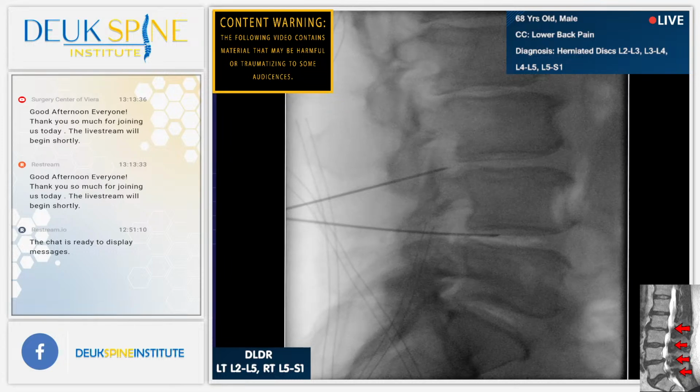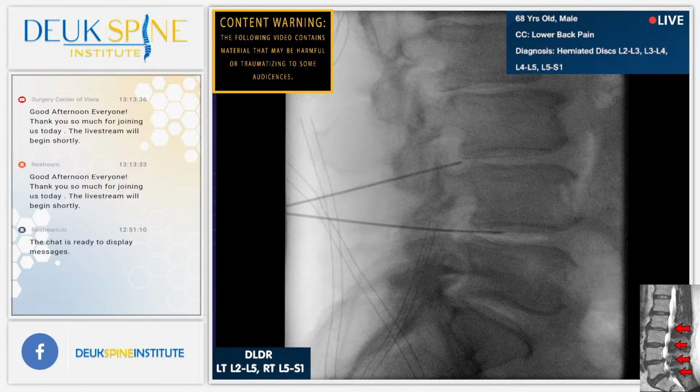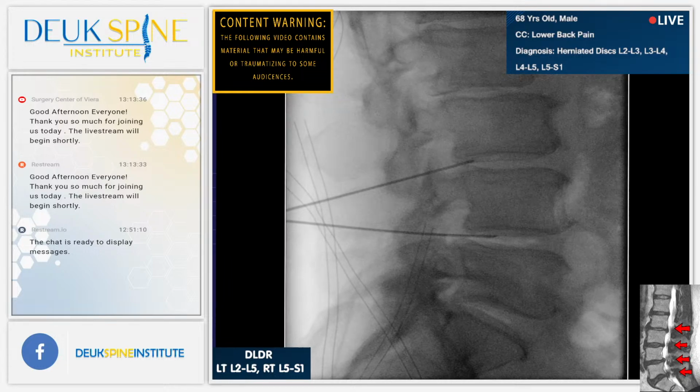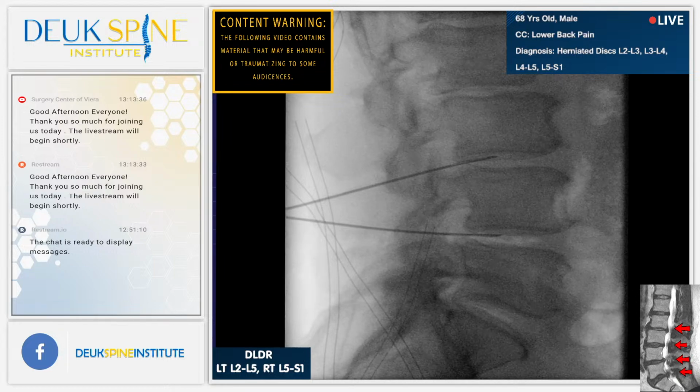But in spine surgery, we use navigational techniques as well. And for spine surgery, we're using the X-ray machine. That's the most reliable tool. But just like the captains used, the tool we're using is the X-ray machine. But what did captains use? Anybody know the name? It was a sextant, right? Hello? Am I right?